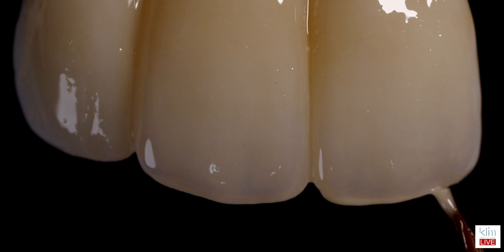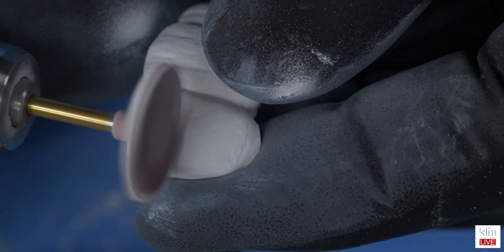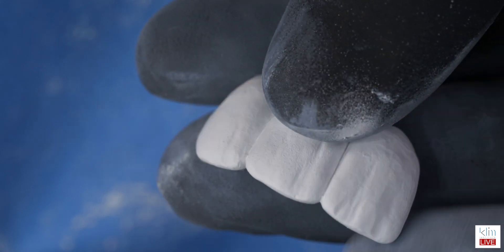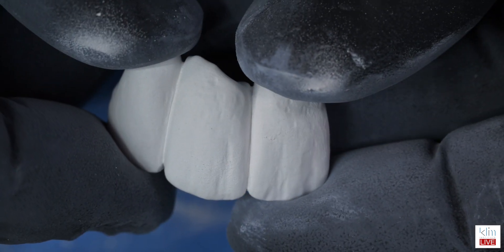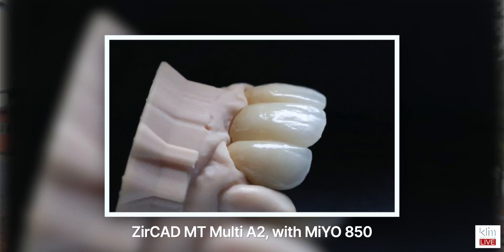What I found interesting is that both with ceramics and zirconia, I prefer to place my surface texture into the material. What I like about the 850 glaze — and you do fire it in the corrective emac cycle — is that it allows that beautiful surface texture to come through. Even though it's slightly neutralized, that's done with a purpose and it really looks nice.